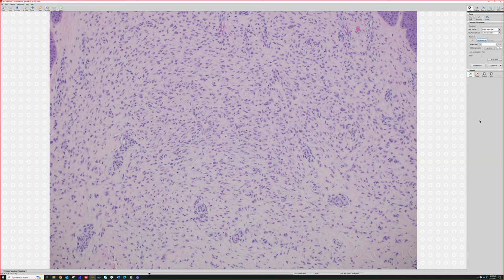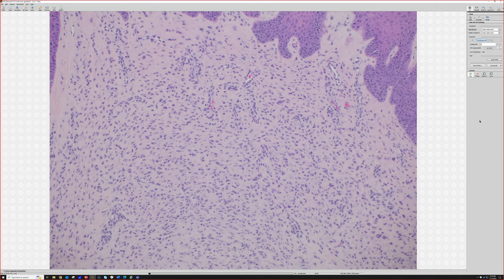other things. So in hemopaths, sometimes they use a different clone, but I can't remember what their clone is that has been used, but I found that clone is often really weak in epithelioid FH or in Spitz things, whereas the D5F3 stains really nicely. So in any case, just be aware of that.